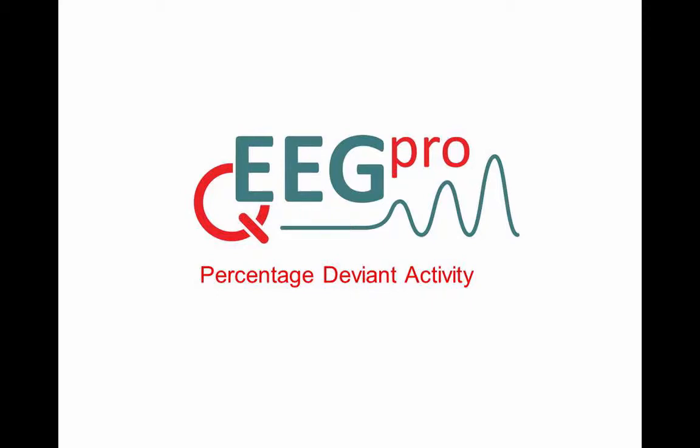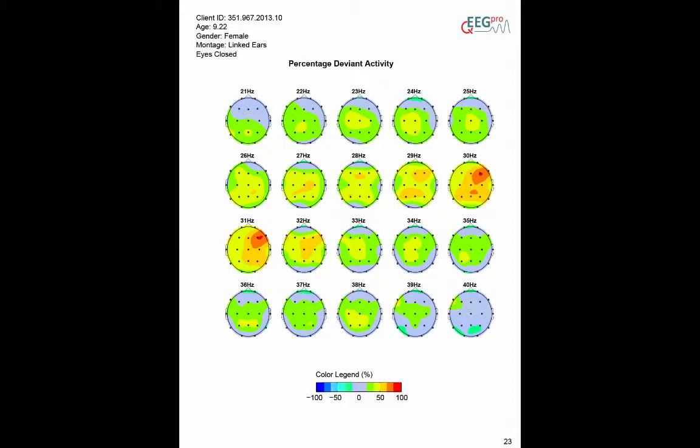Percentage deviant activity. The percentage deviant activity analysis represents the percentage of time that power is deviant for discrete frequencies ranging between 1 and 40 Hz and for all electrode sites. If the average z-score is positive for a particular frequency and electrode, the percent deviant activity is a representation of the time that the power is above a z-score of 2.3, and when the average z-score is negative, this percentage is a representation of the time that the power is below a z-score of minus 2.3.